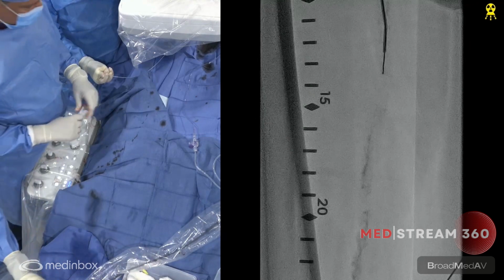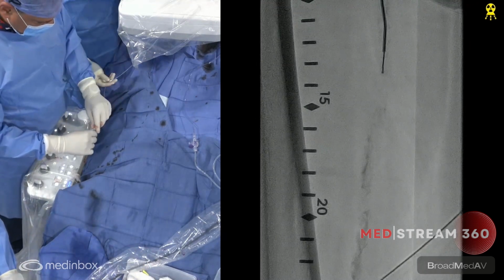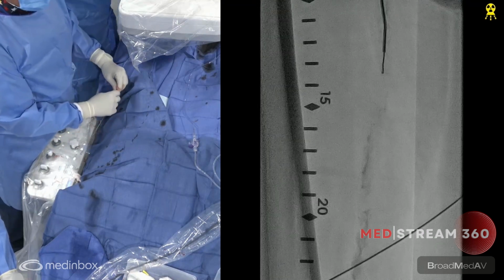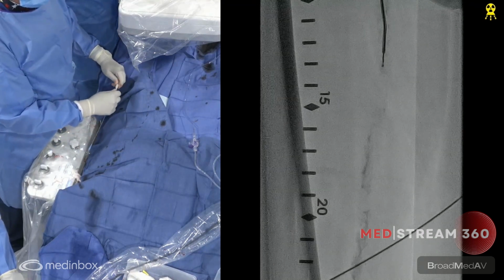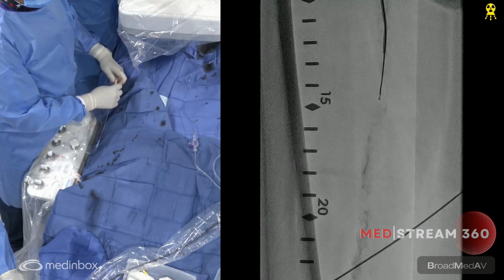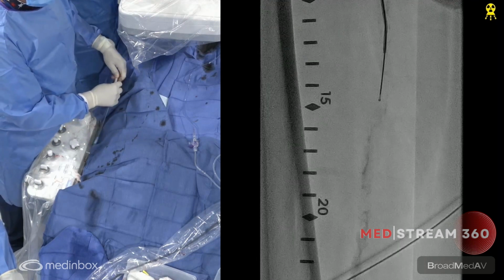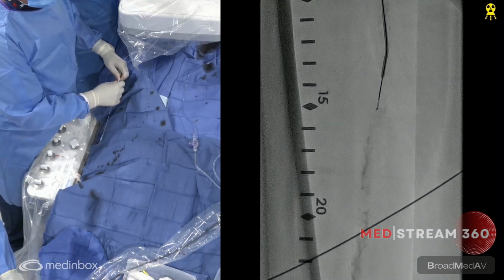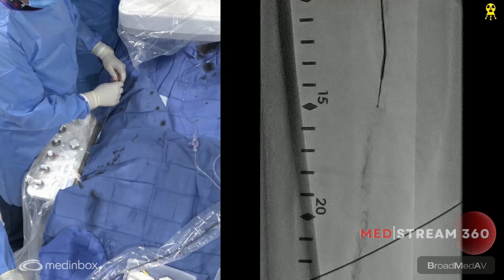So I'm going to take it right to the tip, as you can see. Then I'm going to undo this and take this close and tie it up here. Then all I'm going to do is try to twist this here through. Let's see if it works. And there it goes. See, it's already popped. It popped somewhere. So Ray, advance that catheter a little bit for me. So see, there you go. It's trying to find the fenestration. That's fine, Ray. And now I'm hopefully at the level I want to be.